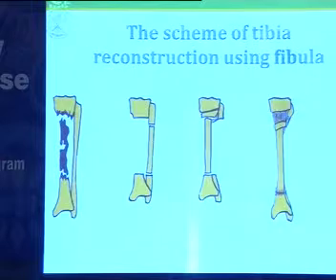Treatment result. The scheme of the femoral tibial synostosis, lengthening of the femoral and tibial fragments, anatomical shortening was partially reduced. The scheme of the tibial reconstruction using fibula.